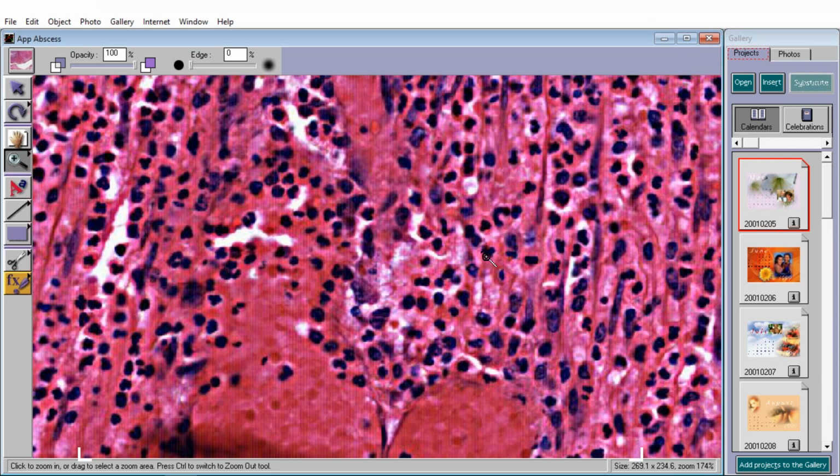Now I'm going to ask you a question. Do most of the cells that you see in this high power field have a spherical, single, round configuration, with minimal cytoplasm, like a lymphocyte? Or do most of them have abundant cytoplasm and a lobulated nucleus? So that's how you know almost instantly that these are neutrophils rather than lymphocytes.